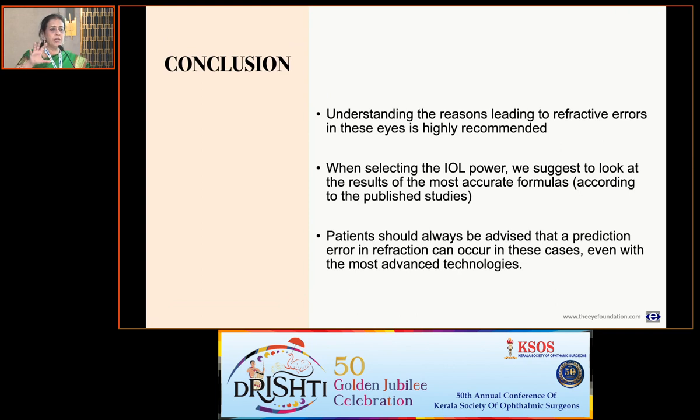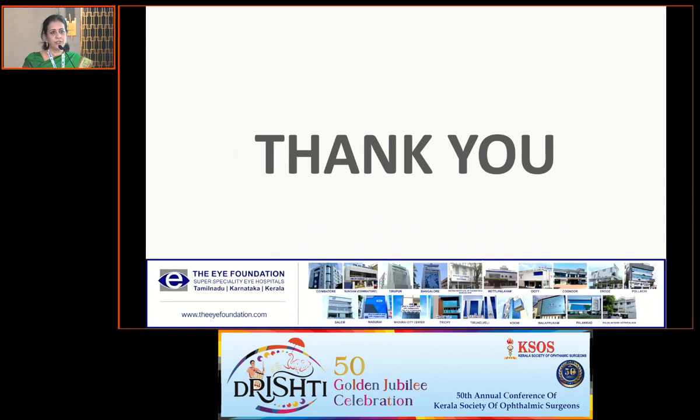So in conclusion, what I would like to say is, we need to conceptualize that there's an error going to happen in K value, in keratometric measurements, in ELP. We need to remember that we need to use the solutions or the latest formulas which have given us an alternate approach. And if you thoroughly understand the science behind biometry, we would be able to do still well with all our post-refractive surgery patients who come for a cataract surgery.